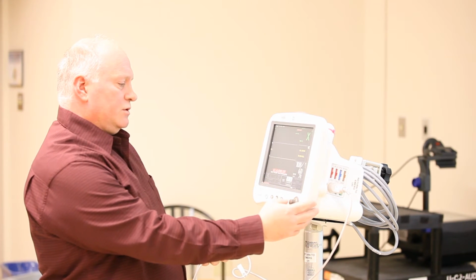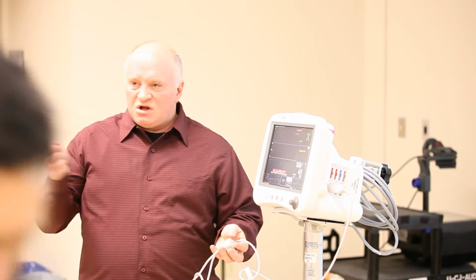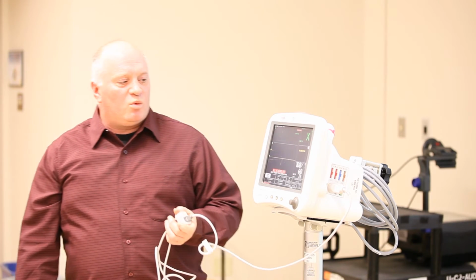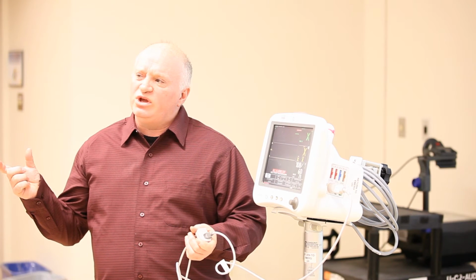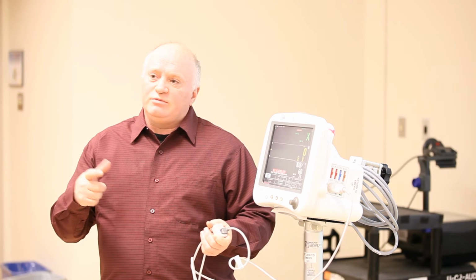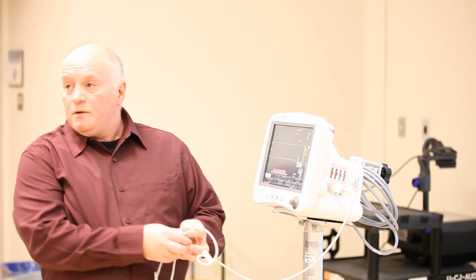Myron, how long does it take to set up the side stream CO2 monitor? Seconds. Seconds? So it's just the main stream that takes 3 to 4 minutes? Click it in. Yeah, the main stream will take 3 to 4 minutes. What we've done with the RT side is we try to have them go down every day and set it up. Now we have a side stream, we don't need to do that anymore. Just plug it in, click, it's there in seconds. It's fantastic. Can I make one comment that Adam shared with me?